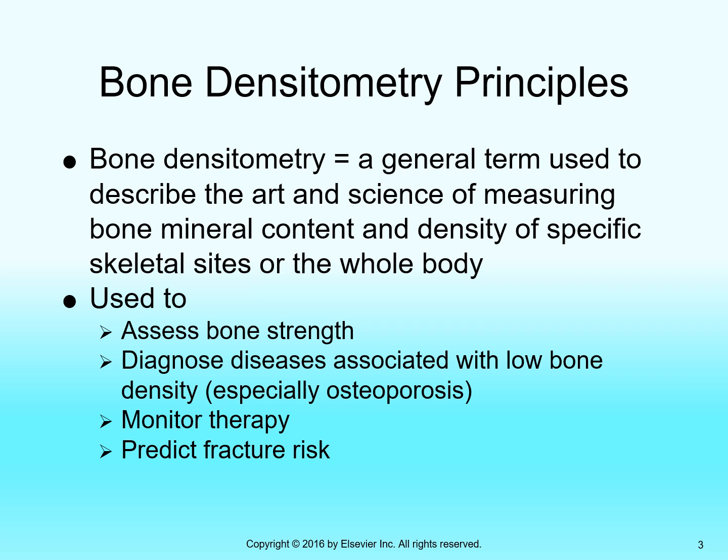Along with assessing bone strength, we can give a rough prediction of fracture risk, because below a certain mineral content threshold and below a certain density, the bone is prone to collapse under itself. Compression fractures of lumbar vertebrae are one of the most common.